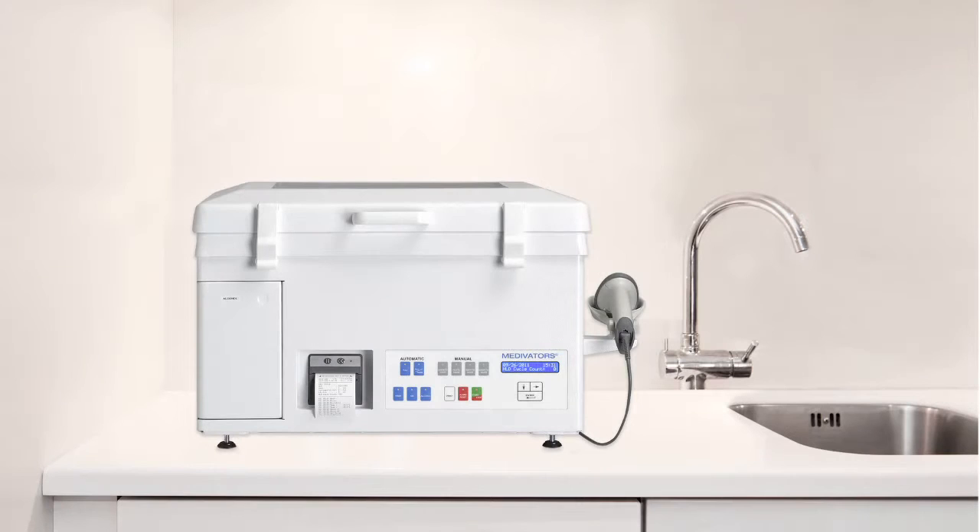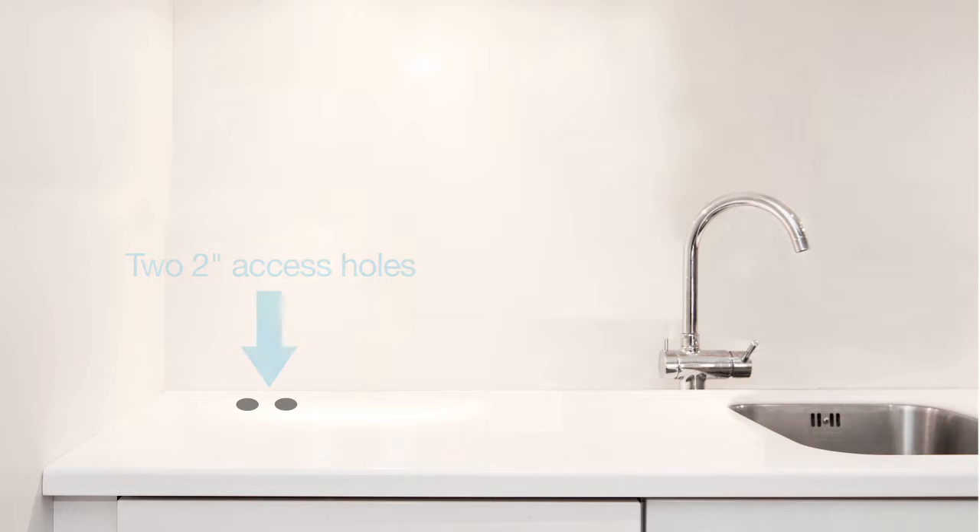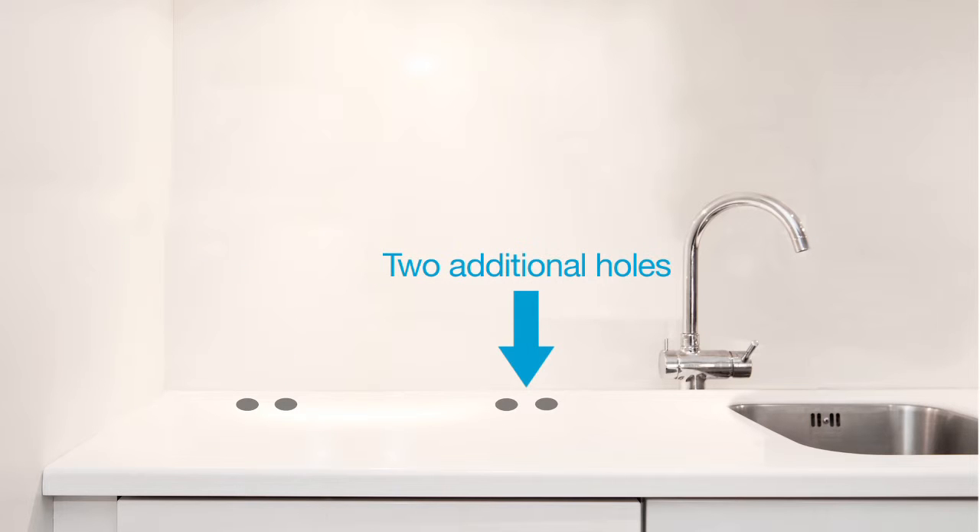To install the CER Optima on a countertop, the counter must be a minimum of 24 inches deep from back to front, and at a comfortable working height. Two 2-inch holes will need to be drilled near the back of the countertop to allow passage of the disinfectant reservoir connection hoses and also the drain hose. Two additional holes are also necessary if the water filtration system and electricity are located under the counter — one hole for the water supply hose to the CER unit and the other for the CER's AC power cord.